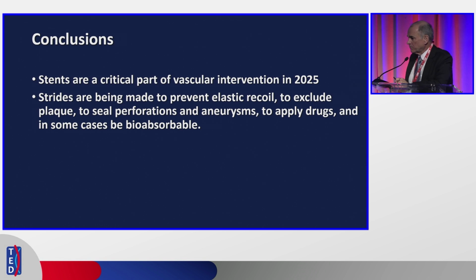I'm actually now the chief medical officer of a company that's just gotten approved for an amniotic membrane covered stent for bronchial lesions, not for the legs. But I am sure curious, as you might imagine, as a vascular guy, to see where that might play a role in the future too. So there's a lot. Stents are not static. Stents are moving as well, and stents are not a sin.